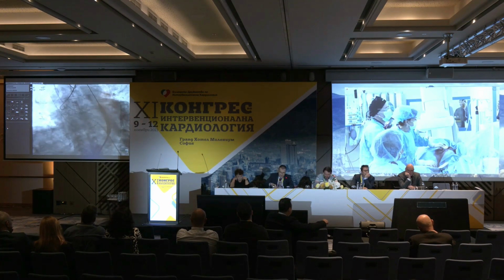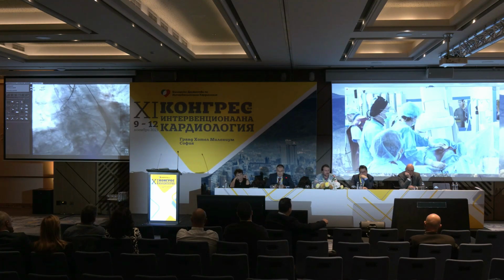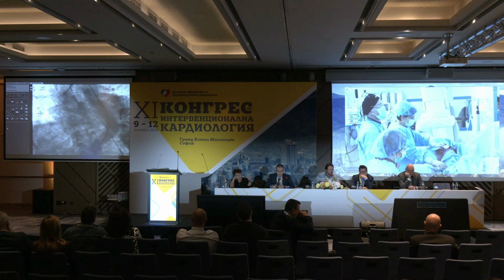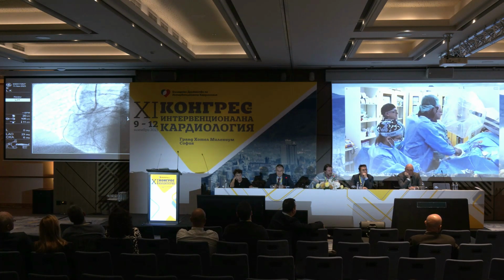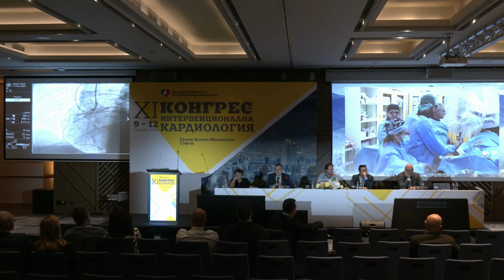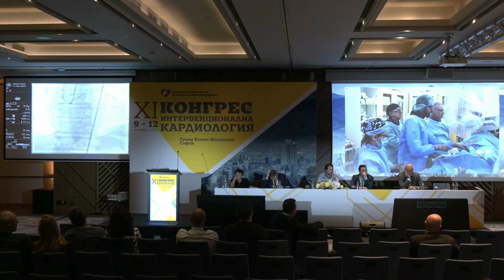I don't know, the colleagues from City are not writing to me. So let's go back to Tokuda, and I will check what the situation is in City. I just want to know how he is going to puncture antegradely. We will see now. We have a better understanding of the case.